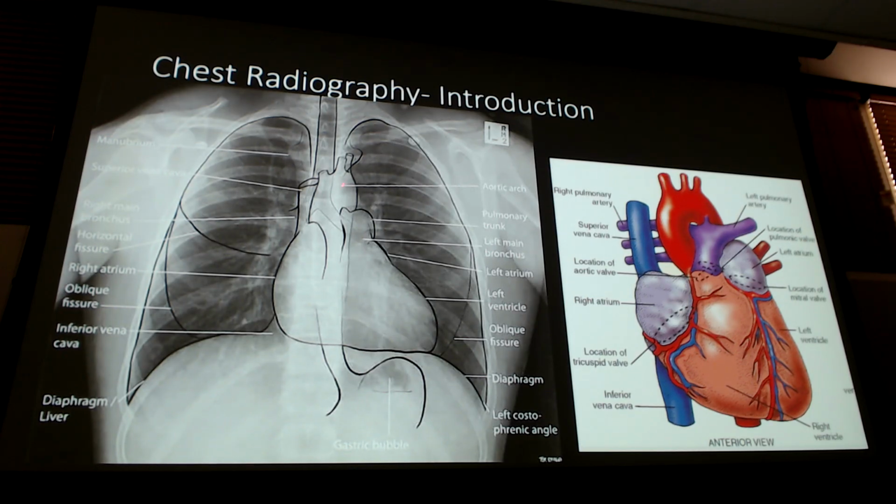Okay? When you come down the spine here, you look at some of these other ones, you'll see a bulge here, the aortic arch. Okay? Then your pulmonary trunk and vessels, then your left atrium, and your left ventricle. So here, aortic arch, pulmonary vessels, left atrium, left ventricle. Almost kind of makes like this little bump, bump, bump, bump down on that side, right?